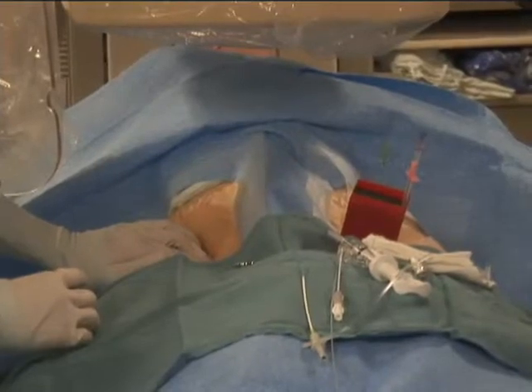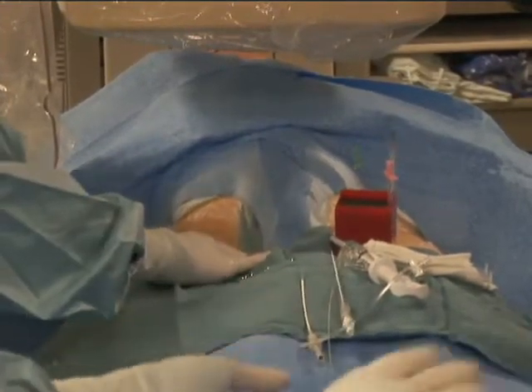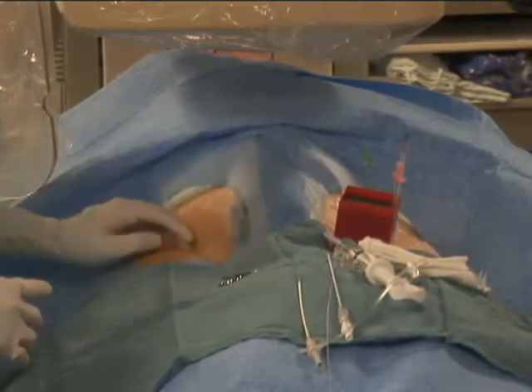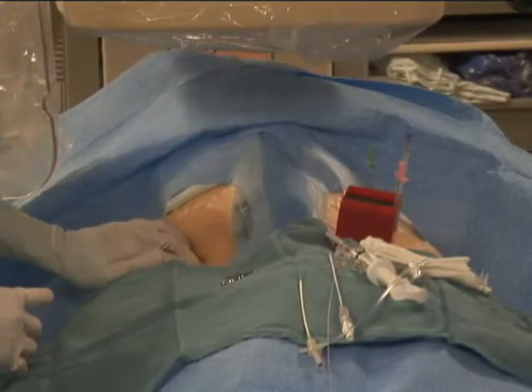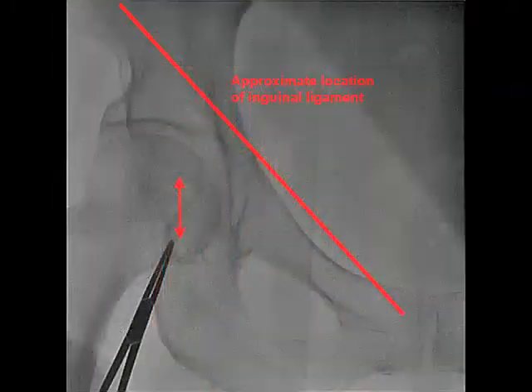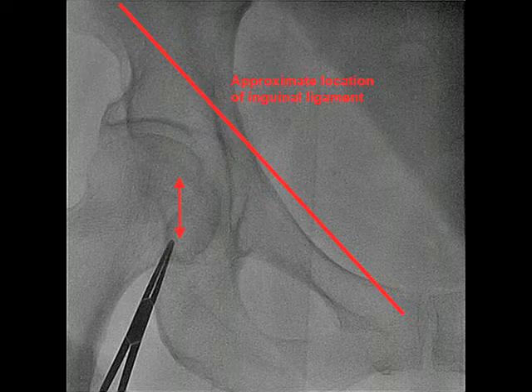The first step in obtaining femoral artery vascular access is to define general landmarks such as the location of the iliac spine, pubic tubercle, and femoral artery pulse through palpation. The objective is to puncture the artery on the anterior surface, below the level of the inguinal ligament, which runs between the iliac spine and pubic tubercle. It is also customary to mark the proposed access point with a hemostat and image the groin area using fluoroscopy.